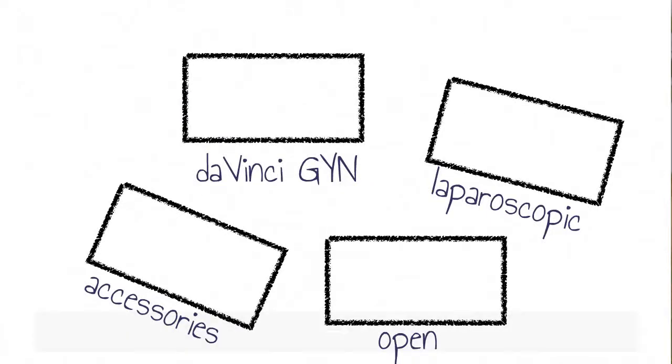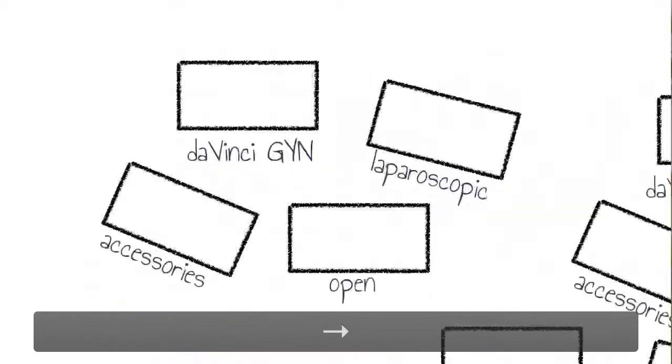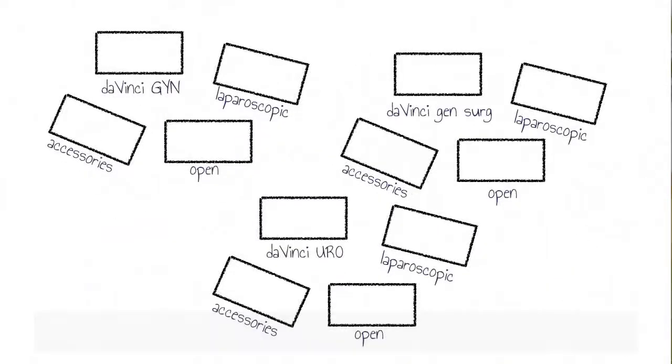How about trays? You can do this with robotic trays too. Unfortunately, hospitals are notorious for saying, okay, we've got our daVinci GYN tray, we've got our laparoscopic, and that's all wrapped up in blue wrapping, and we've got our accessories, and they're in a separate little box with blue wrapping. We have our open stuff that you need to make your incisions and close the wounds, and we do this for our general surgery trays, for our urology trays, and goodness gracious, God forbid you do it for each surgeon, so the doctor gets his name. Ooh, his name is written in felt tip pen on the outside of a blue wrap. This is not a very efficient way to run your operating room.